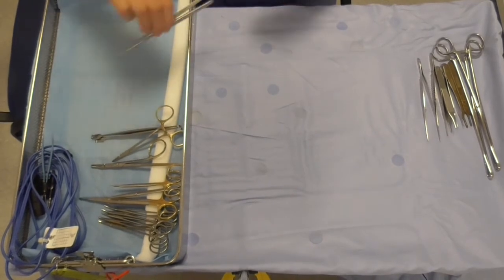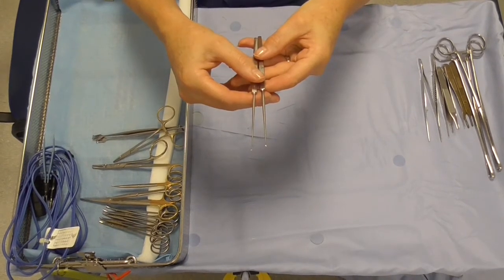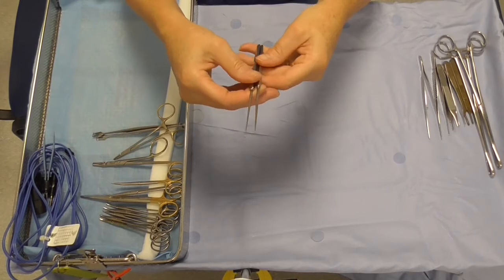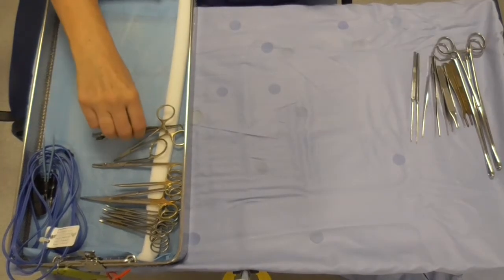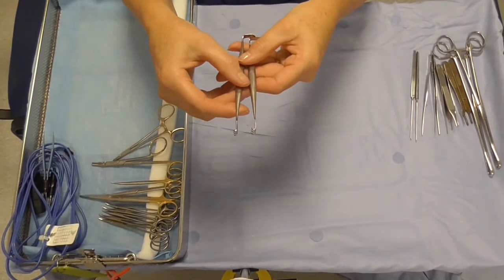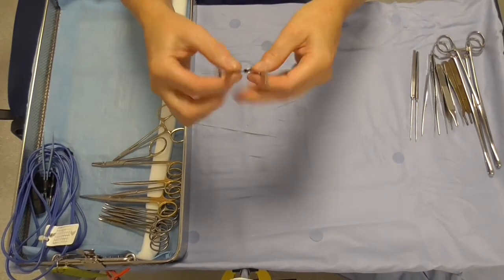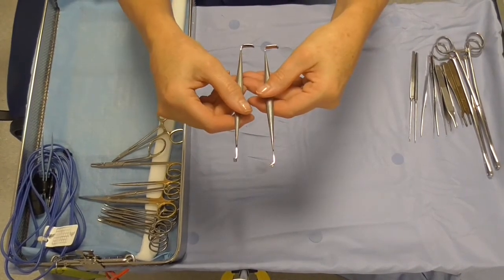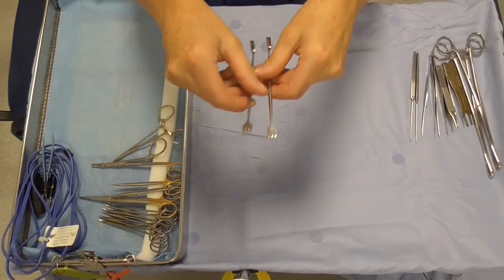We have a couple of retractors here. This is a Gillies skin hook — it's got quite a sharp end on it to retract the skin. And here's the Kilner cat's paw retractor; you can see one end is quite blunt and the other end has got quite a sharp cat's claw effect to it.